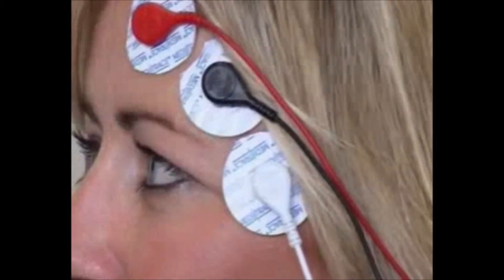As you can see, Belinda has got some sensors over one of her clenching muscles. That muscle is called the temporalis muscle. These are surface electrodes, and these sensors will pick up the intensity, the degree of clenching. We're going to get Belinda to do some clenching and grinding just on her own teeth, and then compare it to two different types of splints and see the difference in what we pick up.